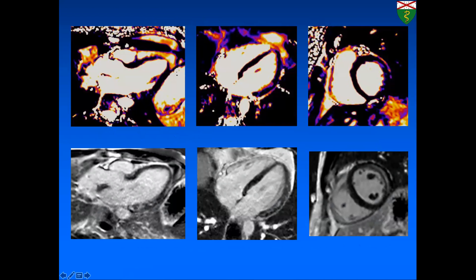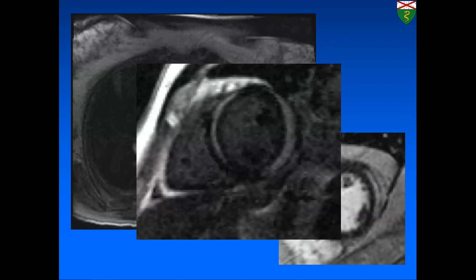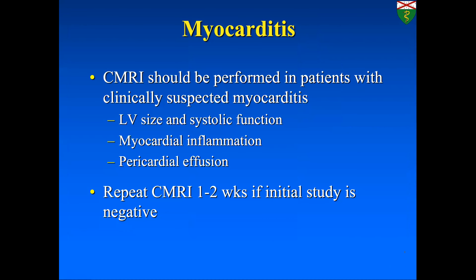In a patient with acute myocarditis, the T2 map shows areas of high signal in the inferolateral basal and lateral wall, with corresponding delayed enhancement that is mid-myocardial patchy in the basal inferolateral wall, becoming epicardial more distally. Other patterns include focal epicardial delayed enhancement and diffuse mid-myocardial delayed enhancement. MRI should be performed in patients with clinically suspected myocarditis to assess LV size and function, look for myocardial inflammation, and detect associated myopericarditis. If the initial cardiac MRI is normal, it is advised to repeat in one to two weeks.